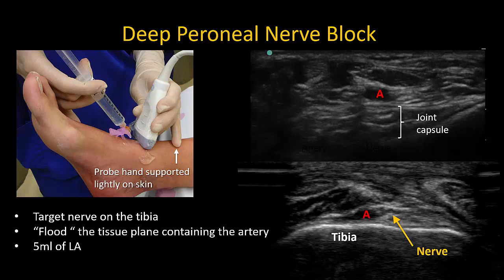I personally prefer an out-of-plane approach to the block, partly due to my training with landmark guided ankle blocks, but also because I can then avoid passing the needle through the extensor tendons of the foot. An in-plane approach can be used if preferred, but try to avoid the tendons if possible. Five mils of local anesthetic is more than enough here to achieve anesthesia of the nerve.